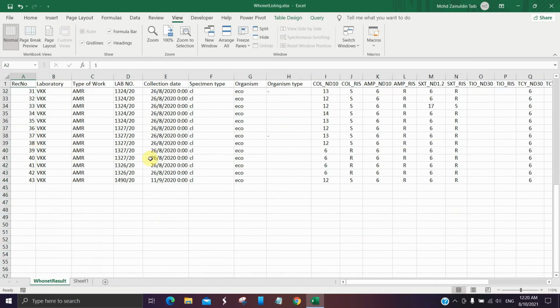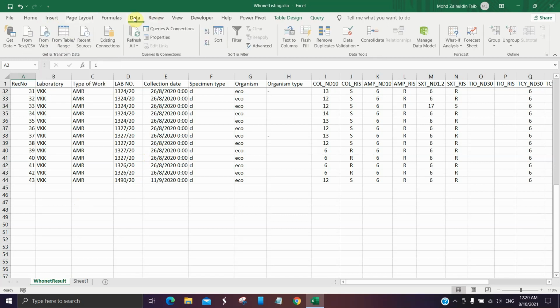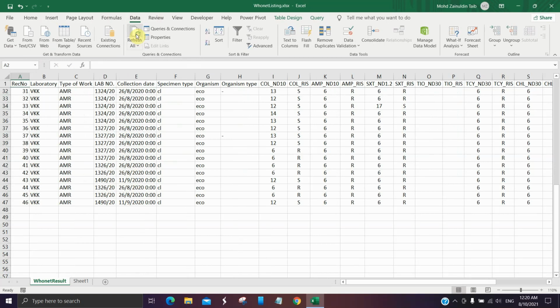We open this one. We only need to do this arrangement once. Every time we have new records, new data, we just need to go to data here. Look at here, the refresh all. Refresh all, and you get the latest additional 3 records in the same arrangement here. Only when we have new data, we just need to click refresh. It automatically appends to our table here.